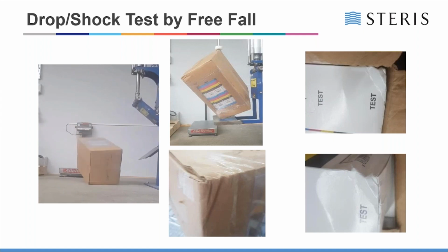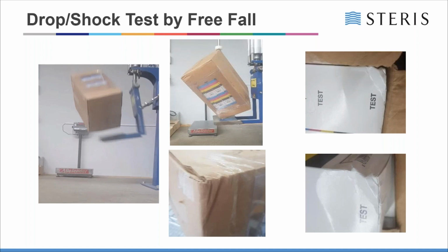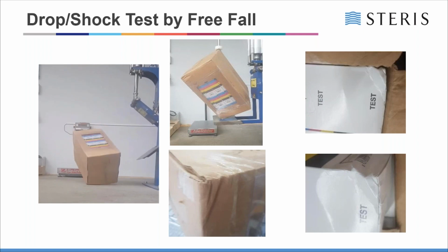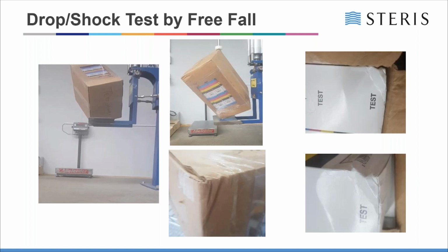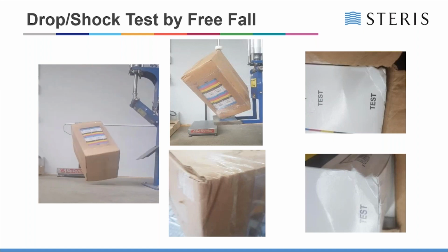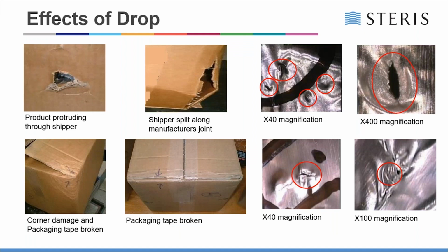But if that's transferred into the product box and further into the actual packaging, or the main primary packaging, is that going to cause an issue? Is the cosmetic damage an issue for you as well? For some companies, absolutely it is. For others, not so much.